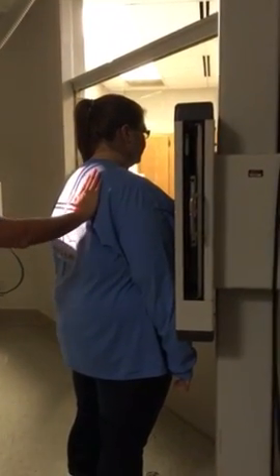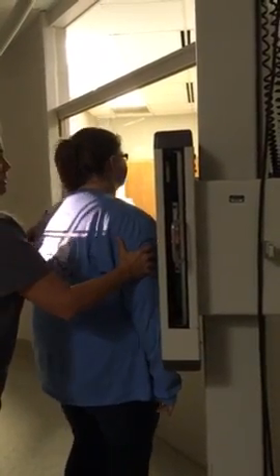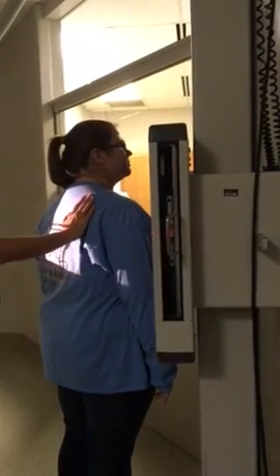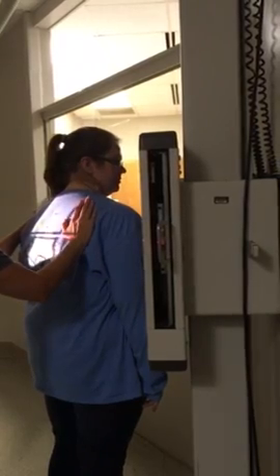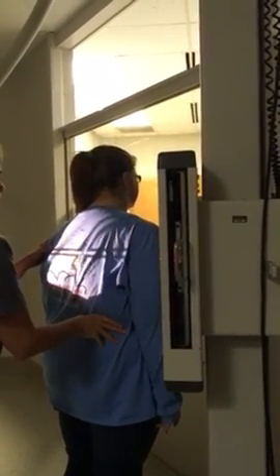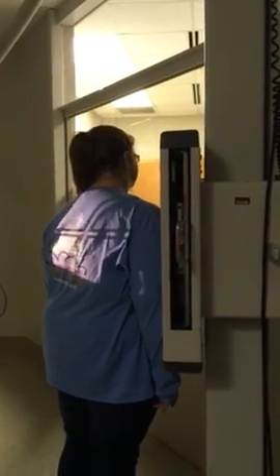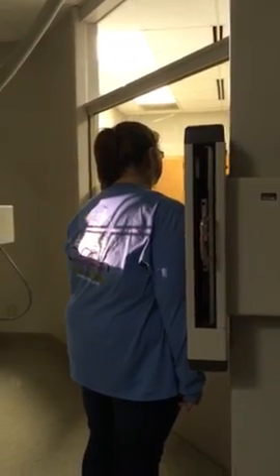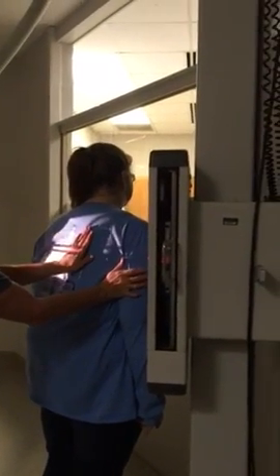Now I put my hand on her scapula. I'll move you over just a little bit. And you're gonna roll her up enough. See my hand? See the shadow? You wanna roll it up enough to be able to see the shadow of my hand. And it's gonna enter right on the border and exit out through the shoulder.